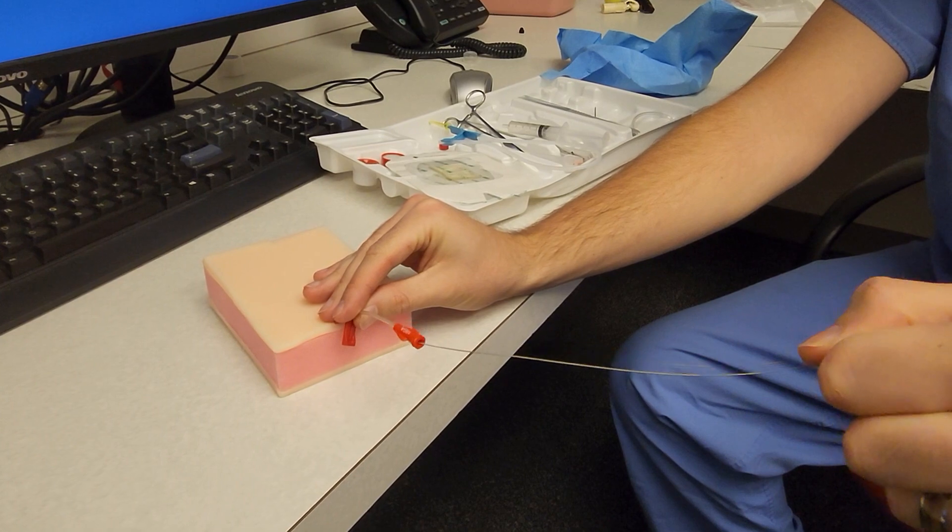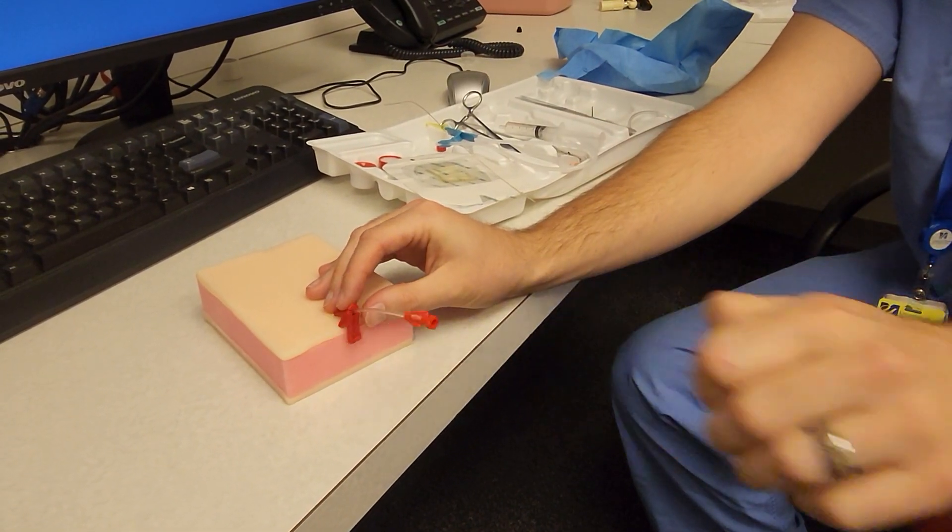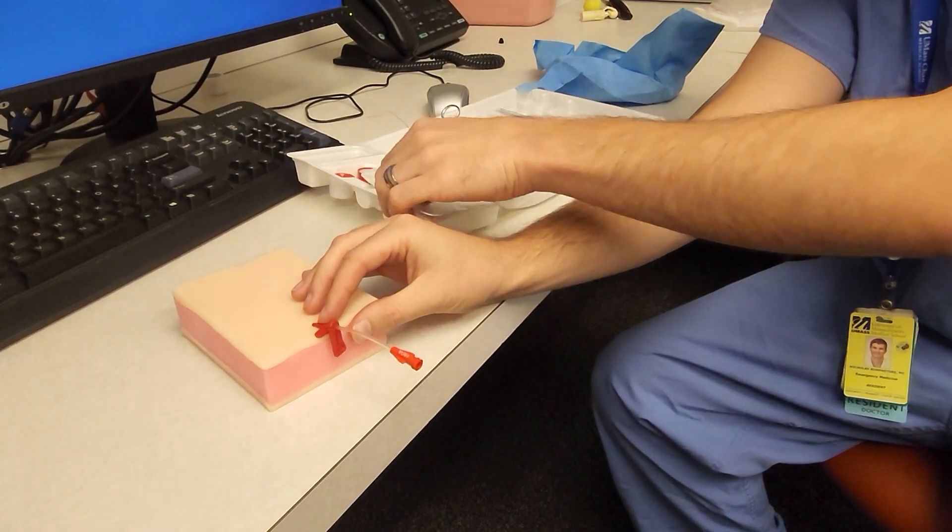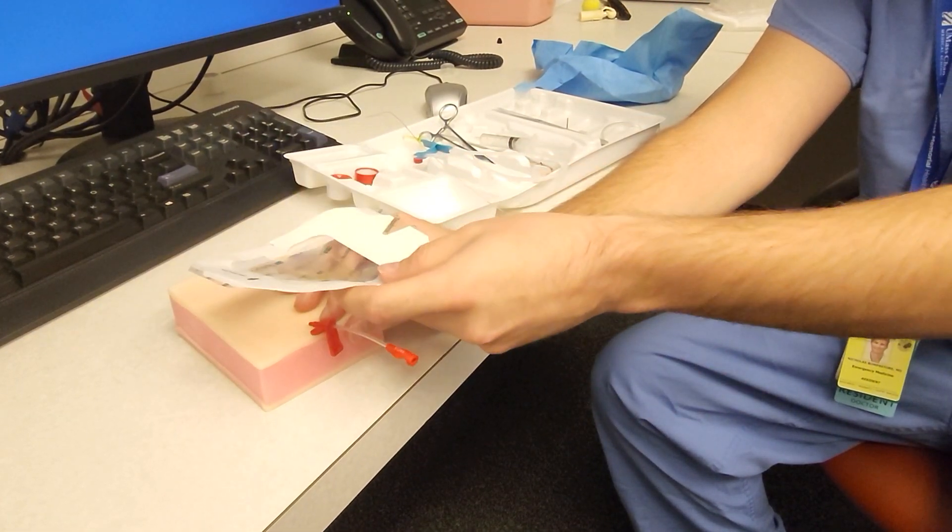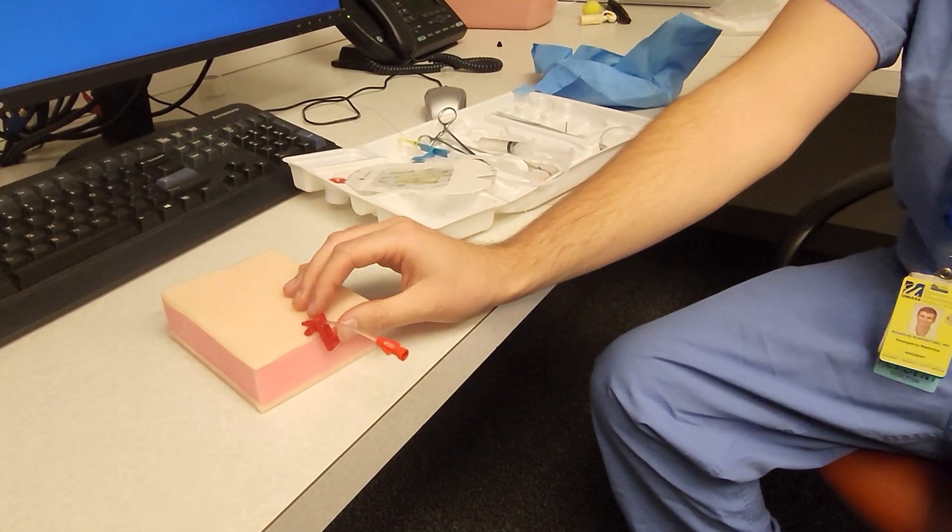Remove the wire and then connect this to your arterial line setup. Suture it into place and place Tegaderm. And that is it.